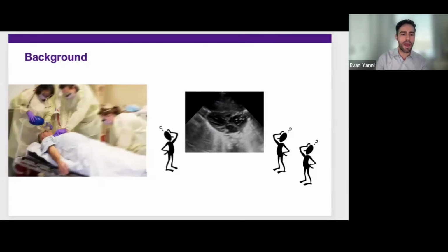And so just for some background, point-of-care ultrasound, we widely use it to diagnose standstill and guide our resuscitations for patients in cardiac arrest. However, both ACEP and the American Society of Echocardiography don't have a formal stated definition of standstill. Furthermore, the definitions of standstill vary quite a bit in the literature.